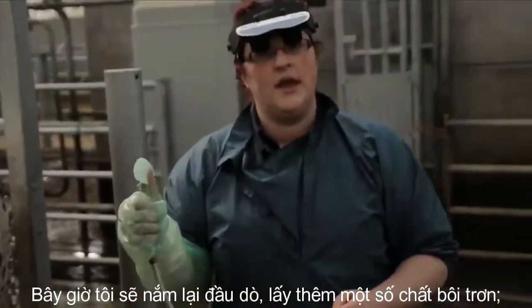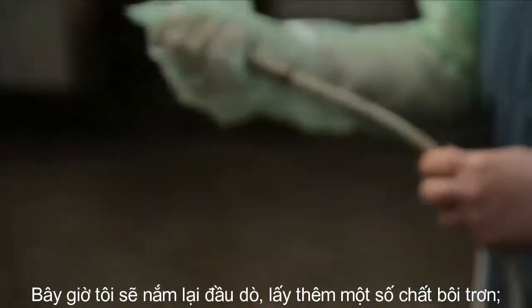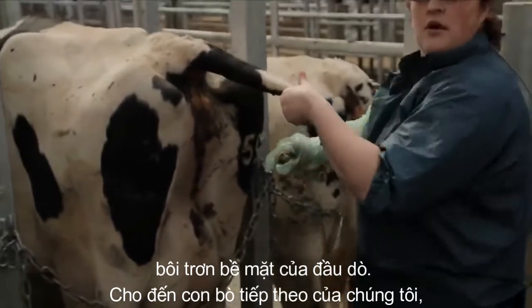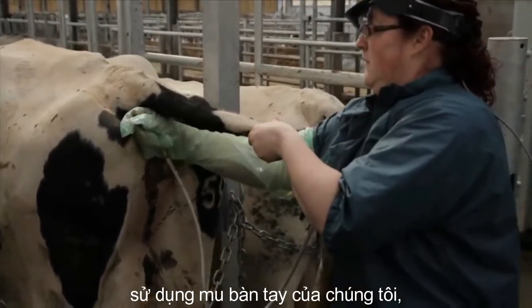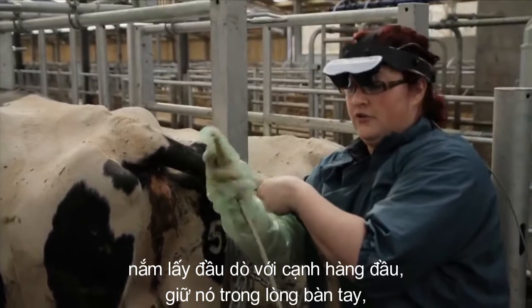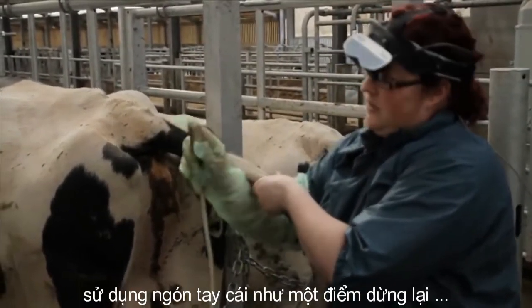We'll now grasp the probe again, get some more lube, and lubricate the surface of the probe. Coming to our next cow, we use the back of our hand, grasp the probe with a leading edge, hold it in the palm of our hand, and use our thumb as a backstop.